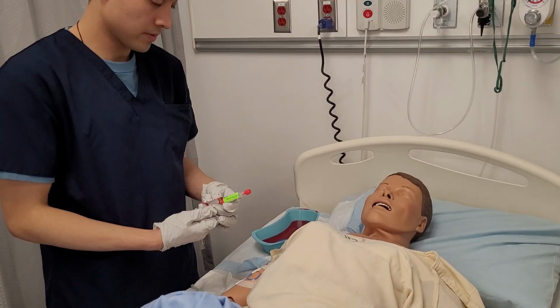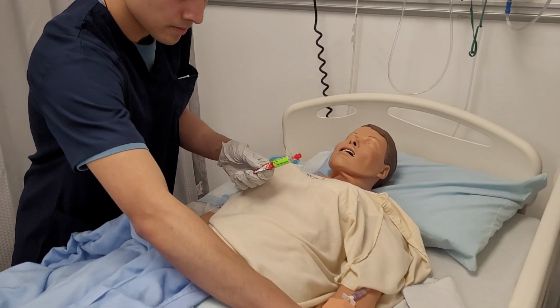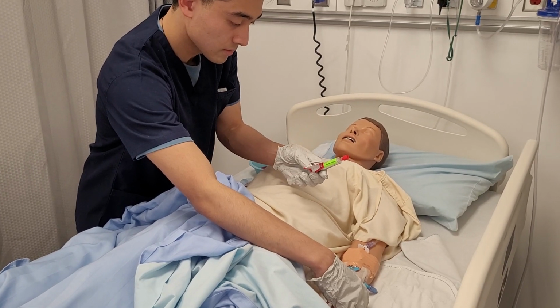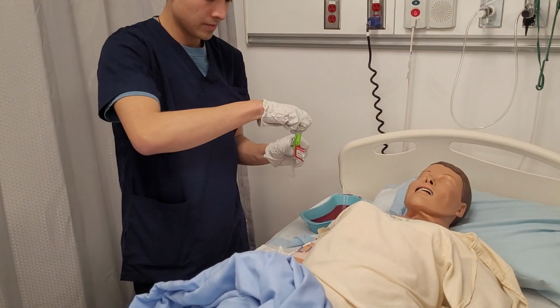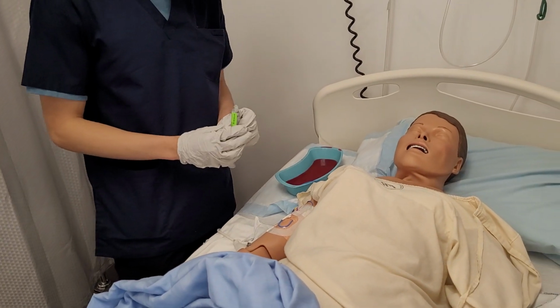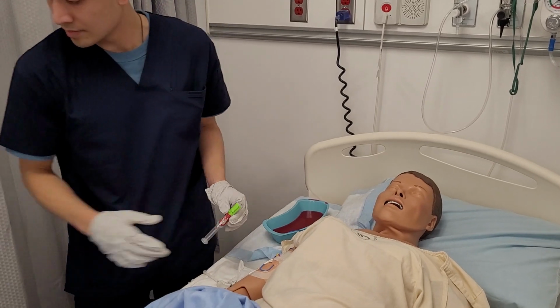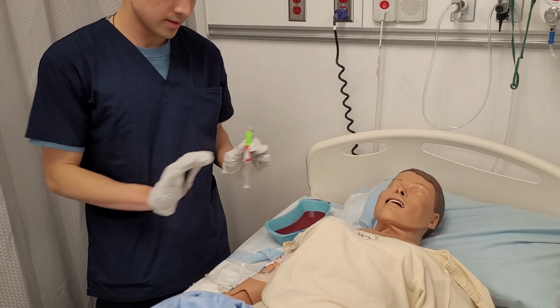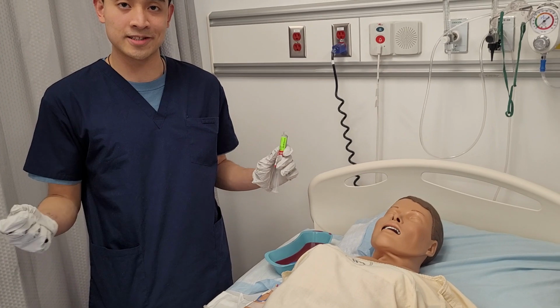All right, Pat. So before I administer your medication, I'm going to make sure I have the correct patient here again. Can you tell me your name and date of birth? Pat Reese, July 4, 1945. All right, cool. Again, you shouldn't feel any discomfort when I give you this medication. Before I give my medication, I already measured my external segment.